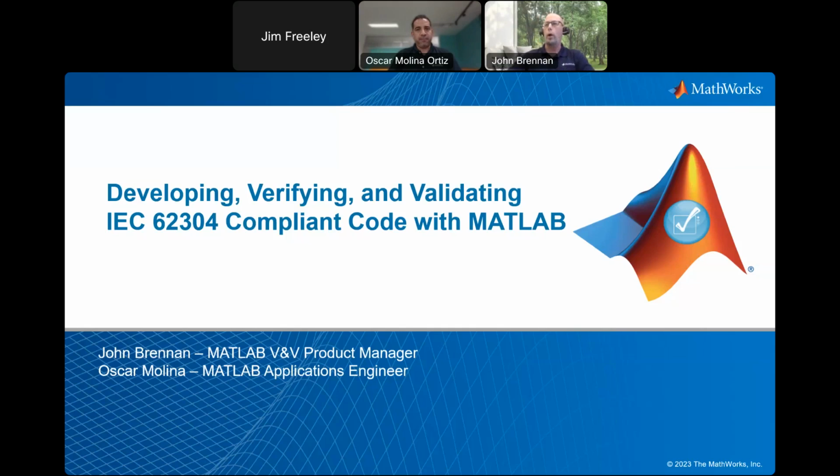So let's start with a level set. This talk is centered around embedded software for medical devices per the IEC 62304. But the concepts that we're talking about can be applied to other medical standards, such as software as a medical device, or even other regulated industries. So it has a relatively broad applicability.